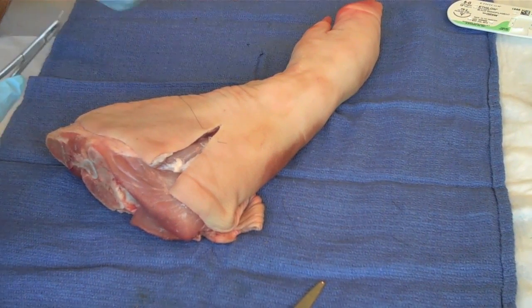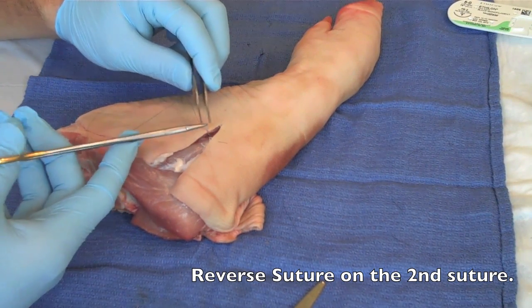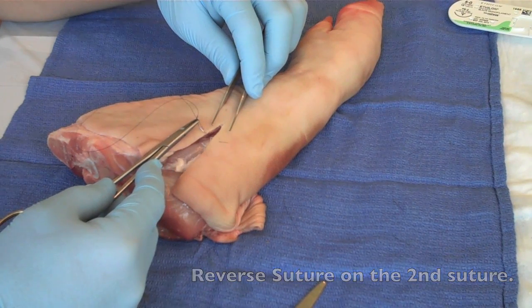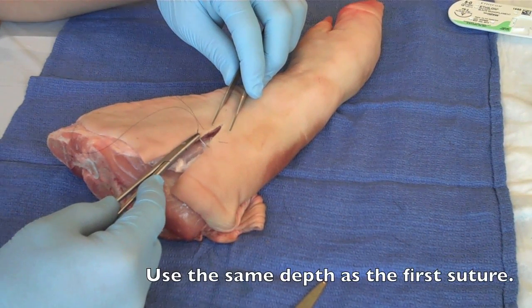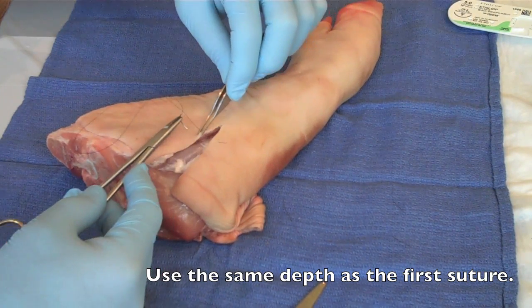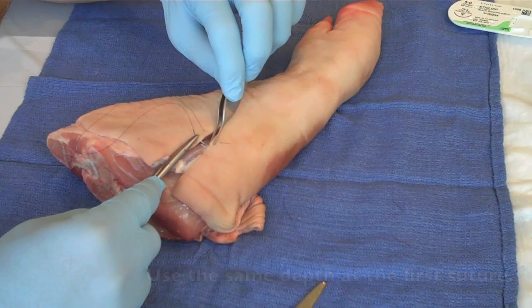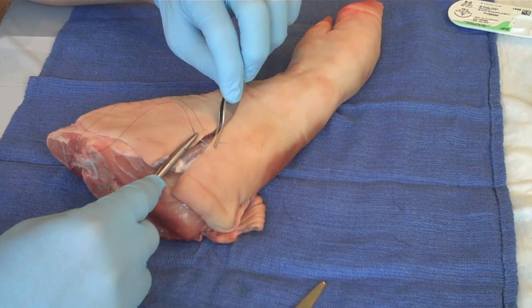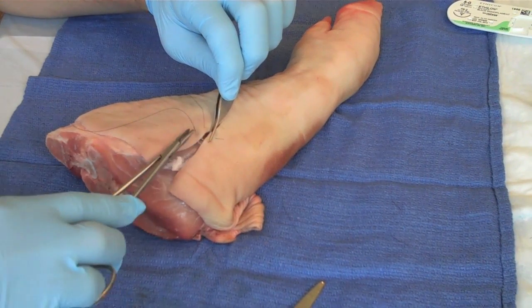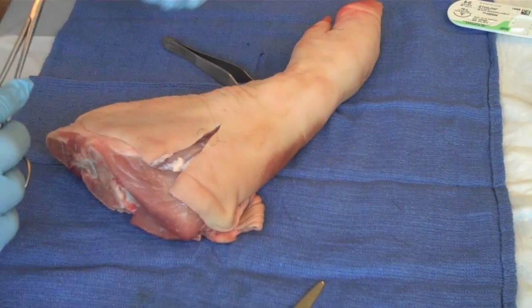You want to back-load this needle. The idea is that you're going to drive through on this plane, then come down a little bit and drive through on the same plane, about a centimeter below. Grab the wound edge at equal depth, work the wound edge at equal depth, come out — never grabbing the point of your needle because that will make it dull.